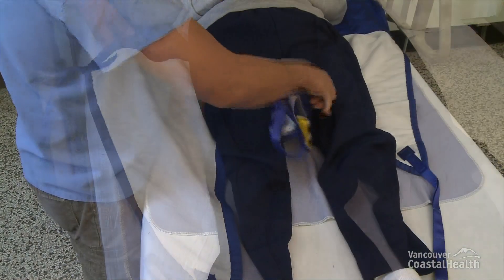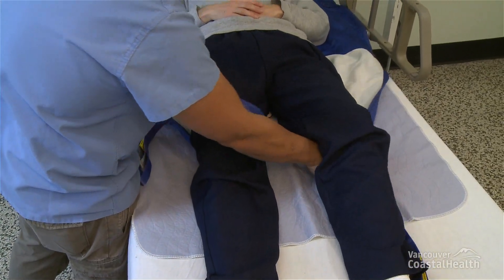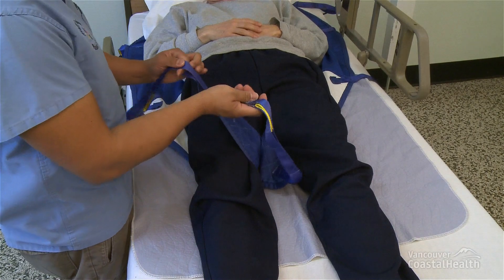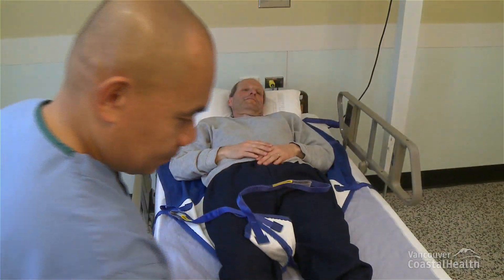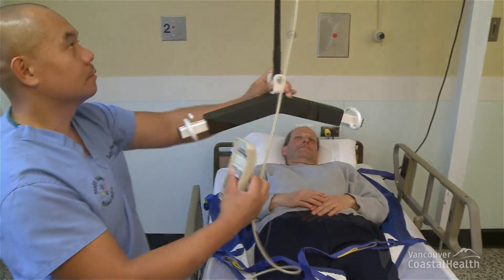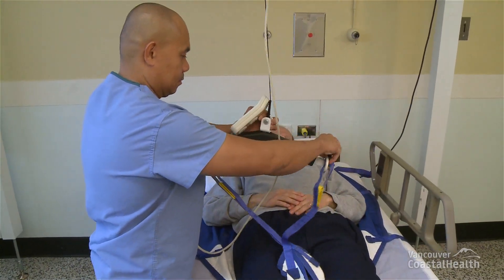If you want to transfer the resident out of the bed, slide the transfer sling's leg flaps under the resident's thighs. Move the lift carry bar over the resident's stomach. Ensure that the carry bar is aligned parallel to the resident's shoulders and start connecting the transfer sling to the carry bar.